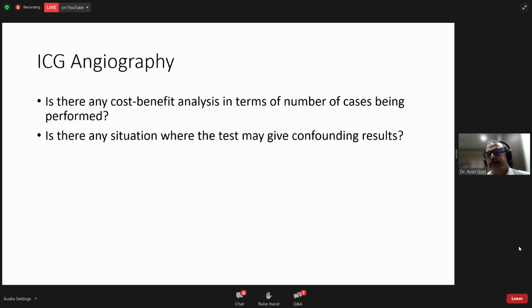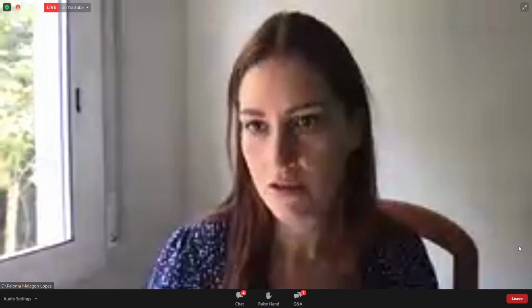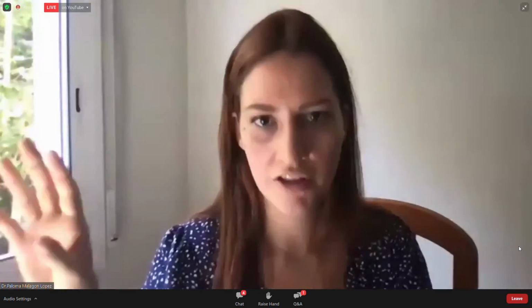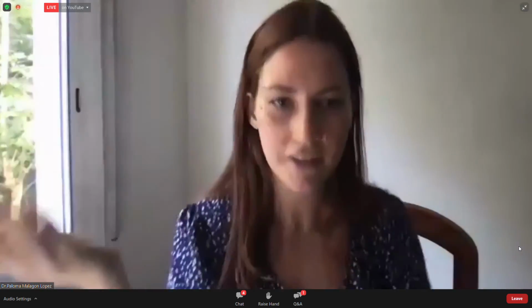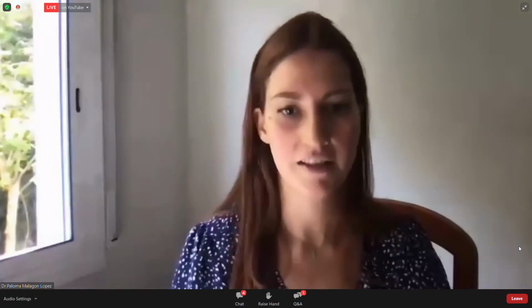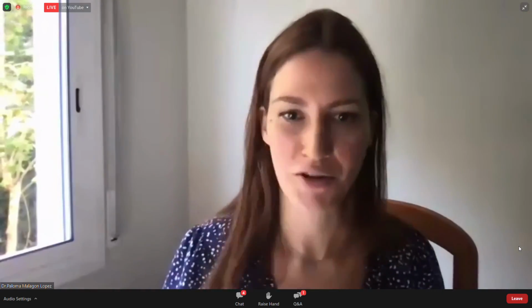Yes, I think we have had every kind of situation with the ICG, because sometimes there is not a clinical correlation between what we see in the ICG imaging and clinically. So the decision is always for the surgeon. I think the clinical experience of the surgeon is more important than the imaging, but the imaging is extra information that we have to take into account. And sometimes the ICG is right and the surgeon is not.